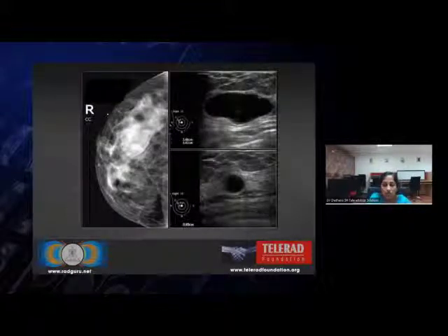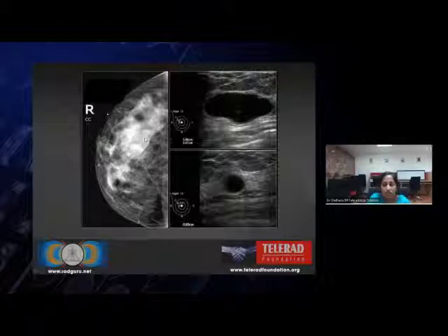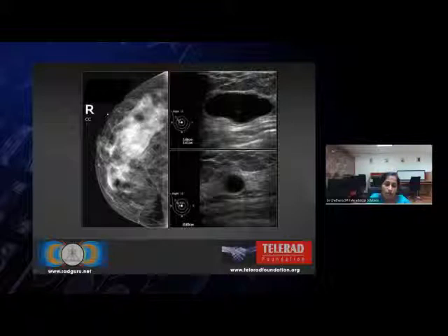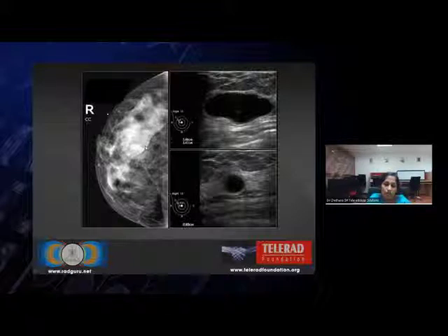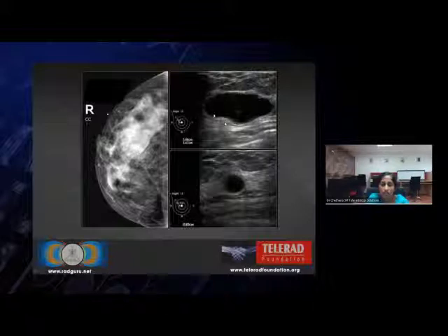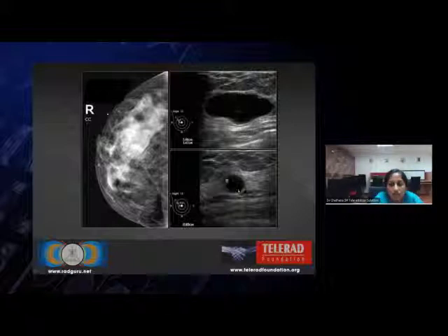This patient presented with pain in the lateral quadrant of the right breast. On mammogram, we see a lesion isodense to the adjacent fibroglandular tissue, which has a partially obscured margin and partially well-circumscribed margin. On ultrasound, this lesion demonstrated the features of a cyst. There is a clear-cut well-defined lesion with anechoic contents. There were other cysts also present, and this is the main one corresponding to the palpable lesion which the patient presented with.